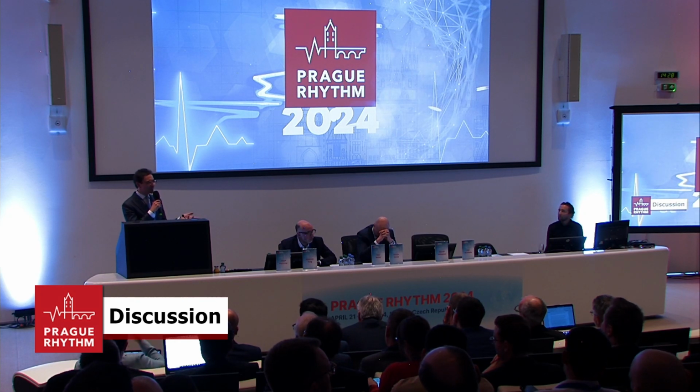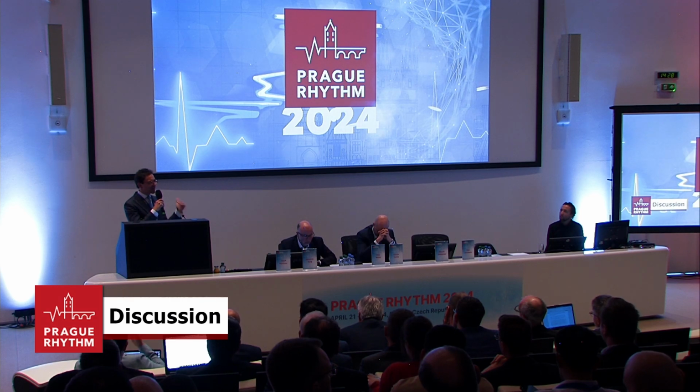It's a very good question. It's very difficult to go in and see. This is what we have been advised to do, to overlap as much as possible. This is our first experience, so we don't know what it will be in the future. But for sure, two out of these 90 patients have come back, and all 4 veins were completely isolated antrally. But that's a very good question. Thank you.